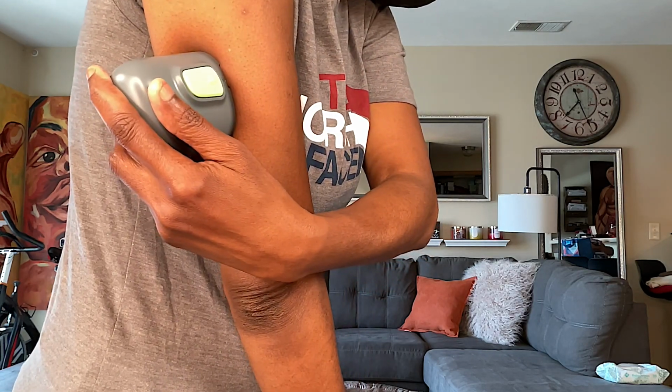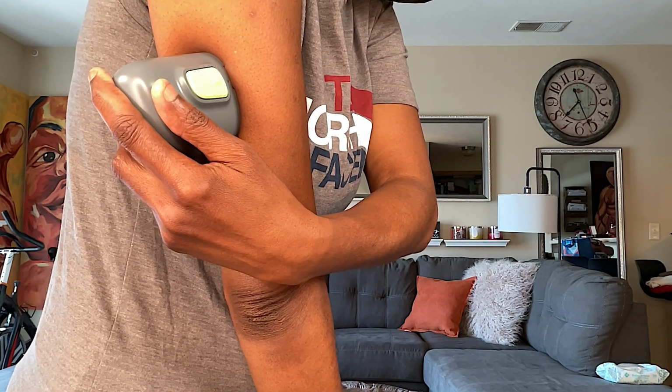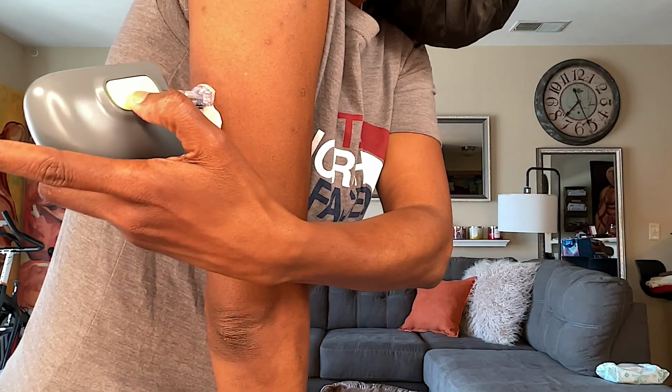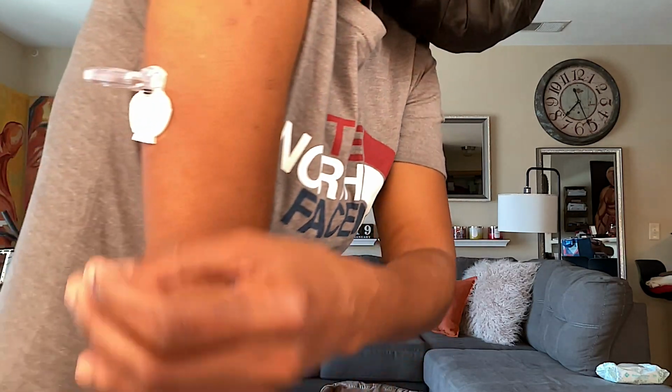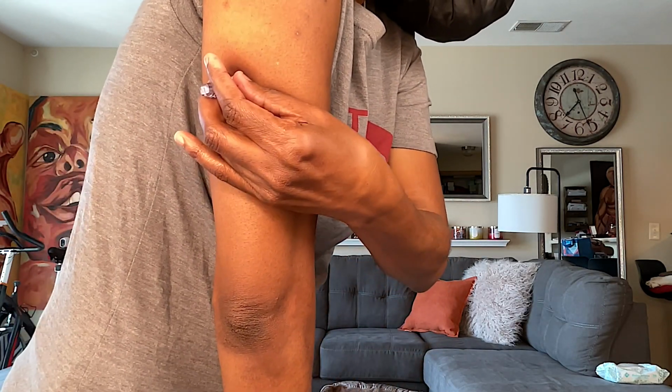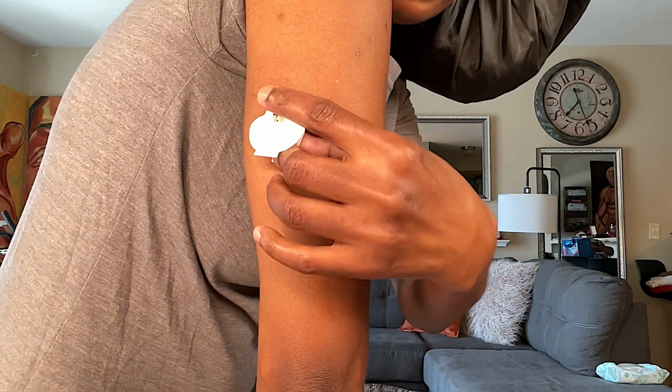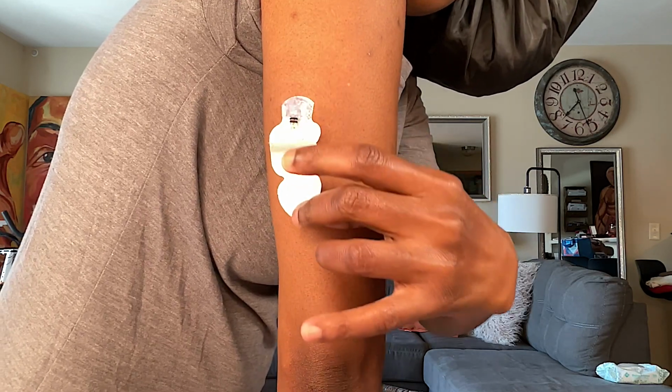The sensor is inserted, barely felt a thing. Now we are just holding for a second, and there we go. And we squeeze, and now the sensor is attached to me. We're gonna use tape that came along with the sensor to secure that to my arm.